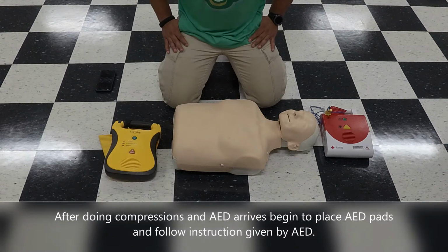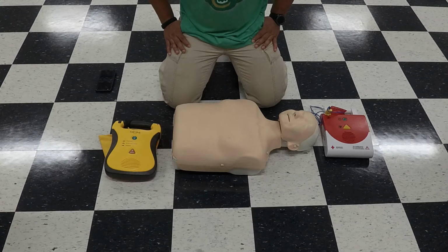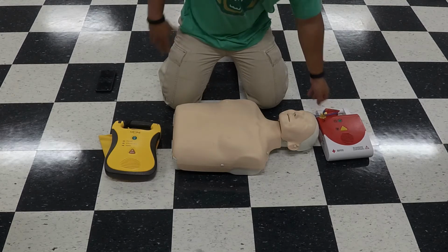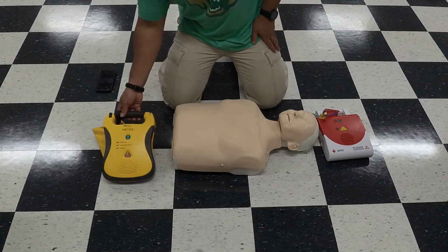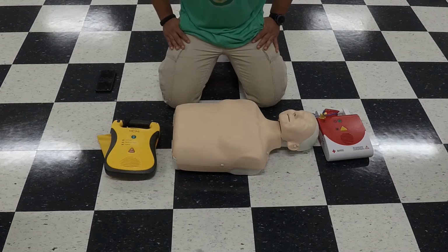Now, upon finding an unconscious individual, you instruct someone to call 911 and also to get you an AED. That's an automated external defibrillator. For the purpose of this exercise, we'll be using this model, but I do want to stress that you will see these in buildings. The AED is the only external source that can get the heart rhythm back to its natural function.